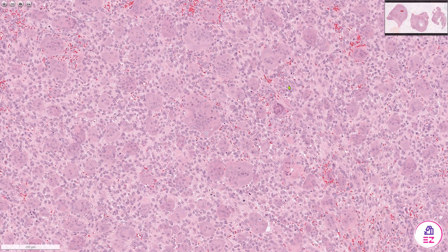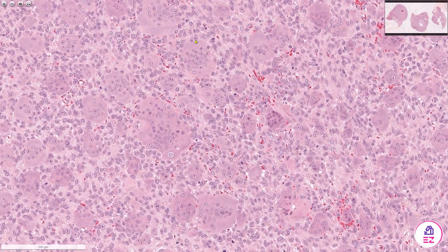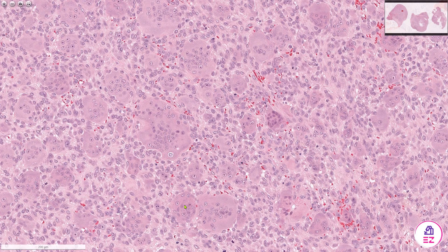If we look at the connective tissue in more detail, you can appreciate that there are multiple large cells. This one in particular is very large, and the thing of note is that they have multiple nuclei. Each of these large cells is a multi-nucleated giant cell, and that is the hallmark cell of this pathology.